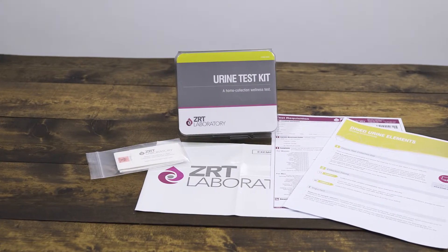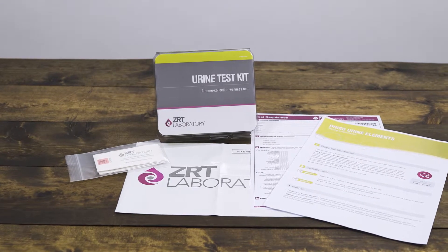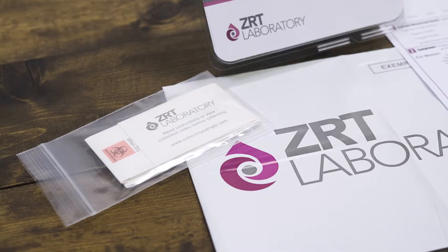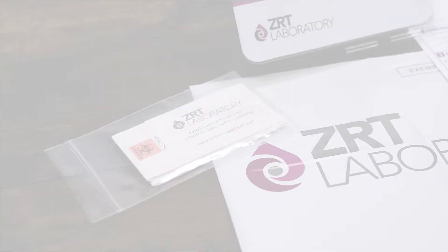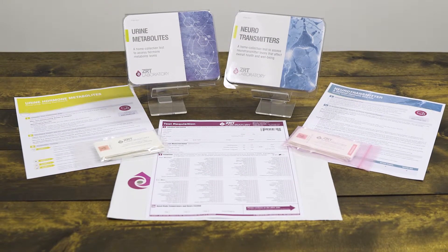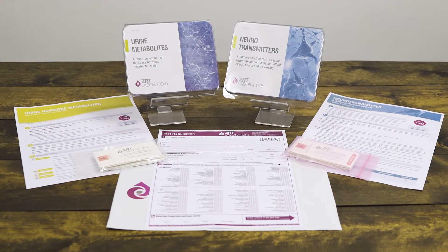Next, lay out the materials that came in your test kit. For elements testing, there will be two urine collection cards — one to be used in the morning upon waking and the second to be used at bedtime. For neurotransmitter and hormone metabolite tests, there will be four cards.